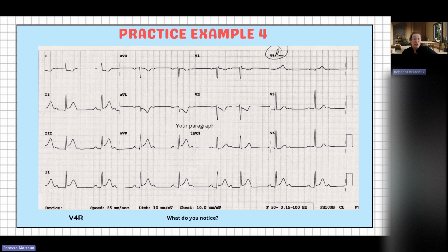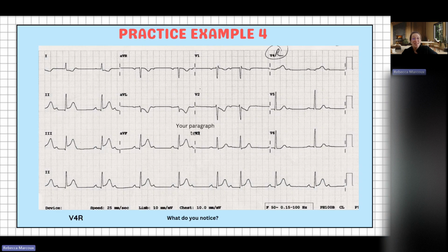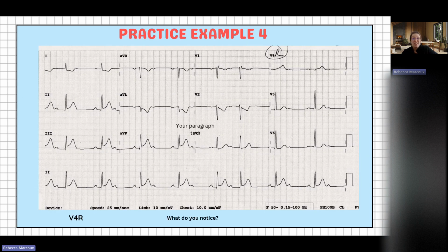The other thing that's different is that, if you interpreted this ECG, the patient flipped themselves into a second degree type 2 rhythm. If you look here, they're in this nice regular rhythm, and you can actually see it's captured on the 12 lead that they flipped. There's a pause here. They flipped themselves into a second degree block, which is again another sign of probable right ventricular involvement, because our RCA provides blood to the SA node and the AV node.